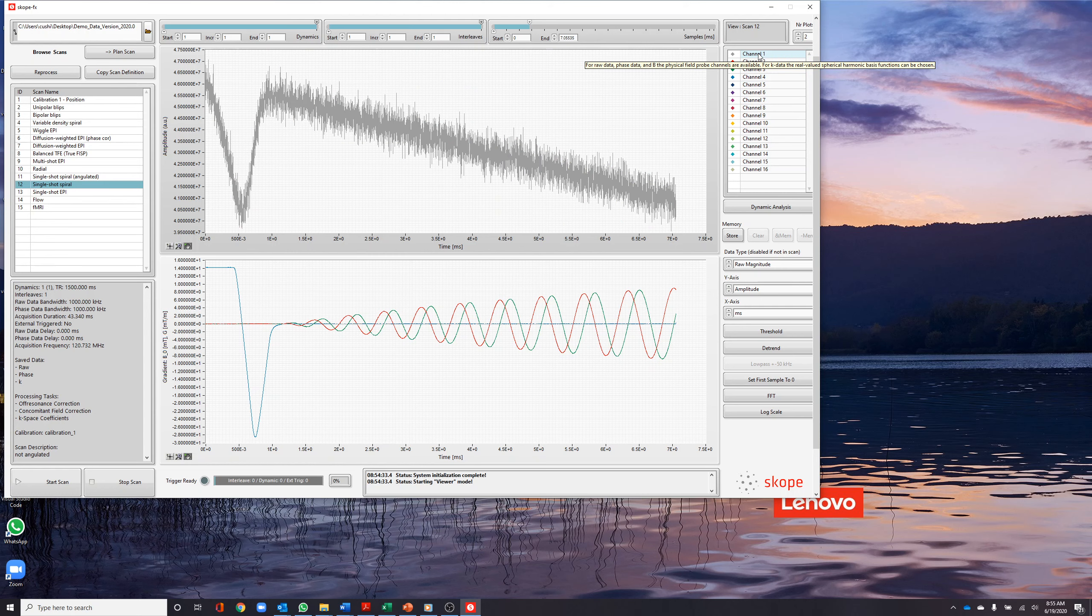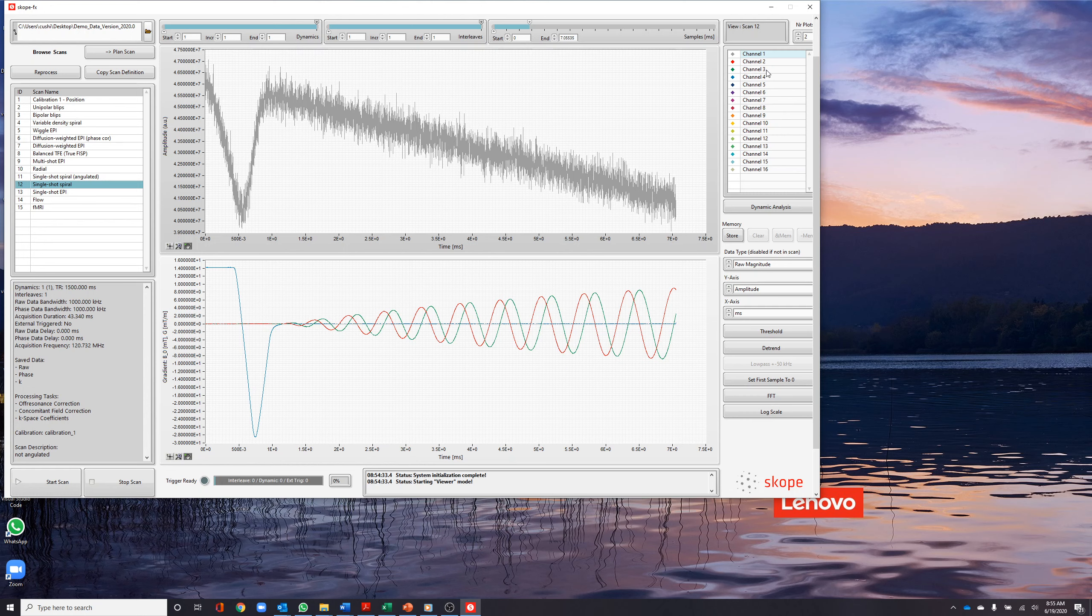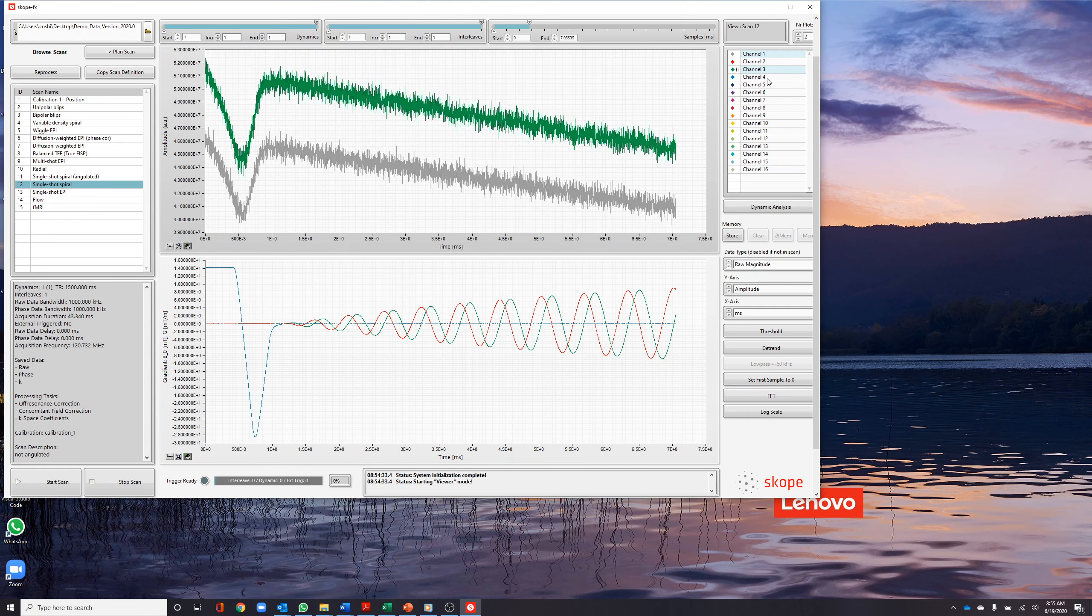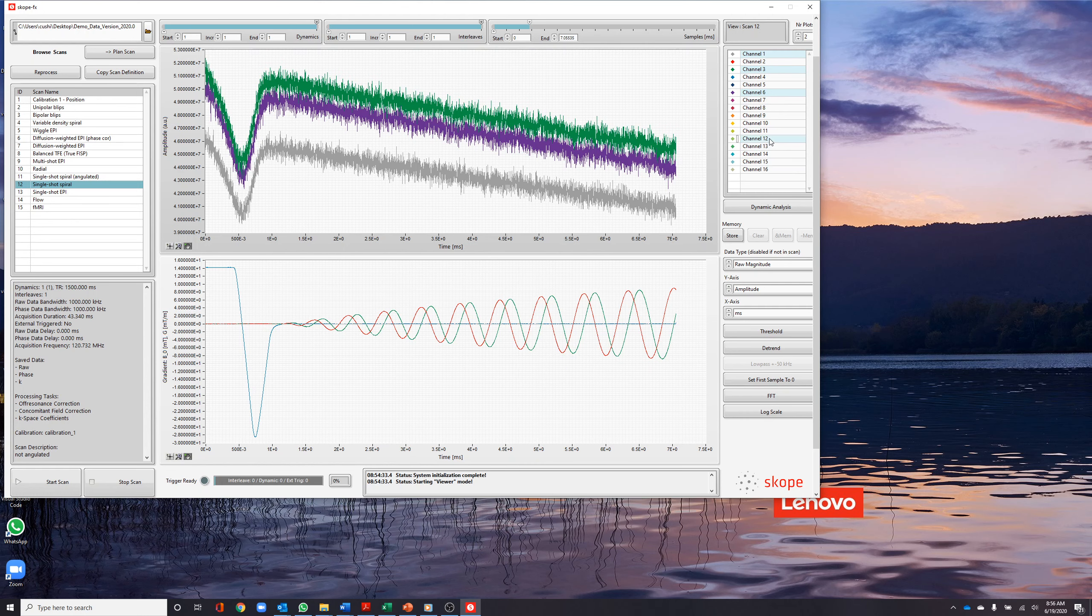We can visualize all of the probes together in the center window or by selecting one or more probes in the channel selection box, we can visualize the probes of interest.